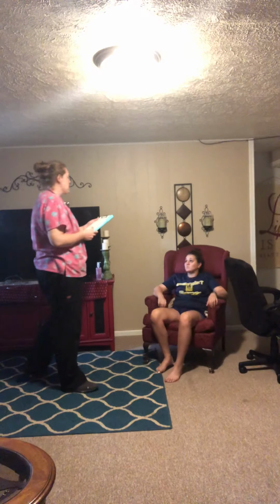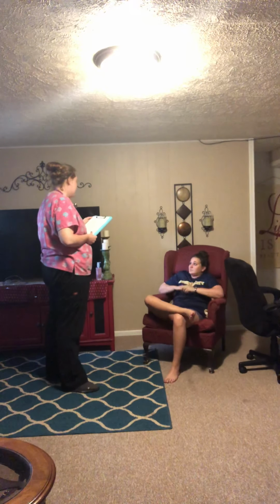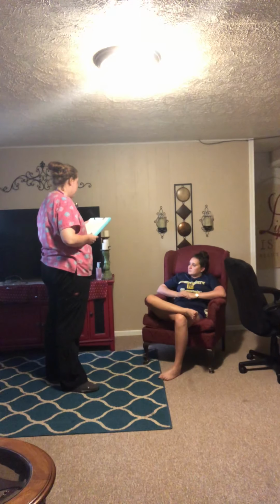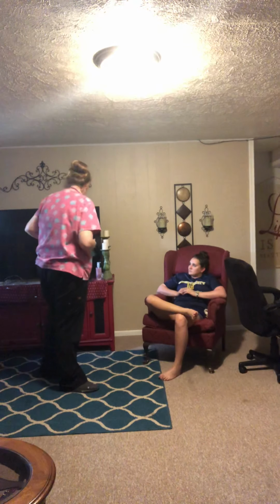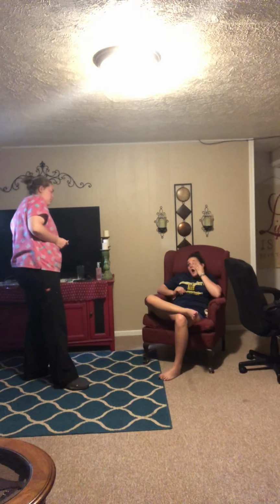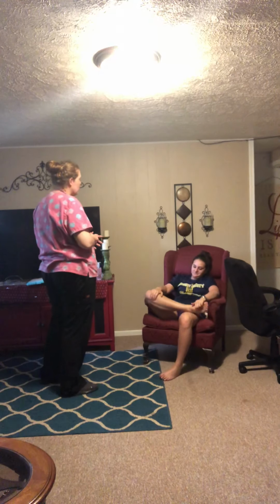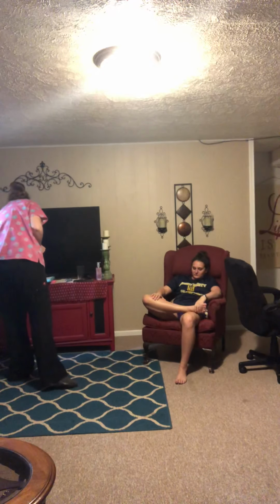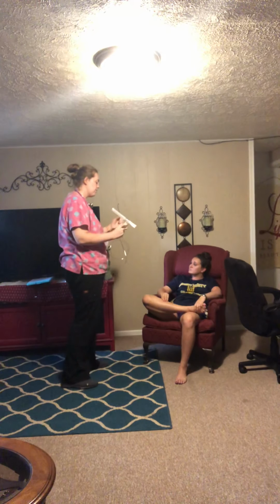Alright, Ms. Pribble, so today it looks like your doctor has ordered for you levalbuterol, aclidinium bromide, and Symbicort. Those are each in different types of inhalers, so I'm going to show you how to use those today. The first thing we're going to start with is the levalbuterol, and we're going to take that in a small volume nebulizer. That's something we're going to take every 4 hours, and it's used to help open up those airways. Okay? So this is what a small volume nebulizer looks like.